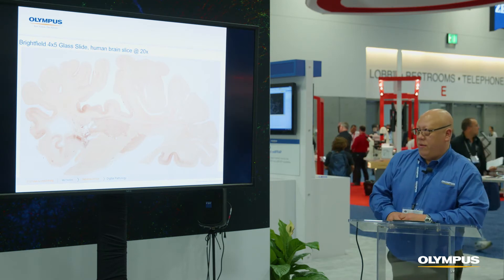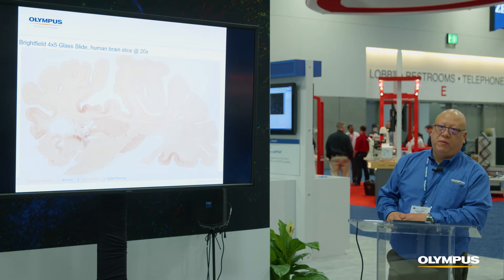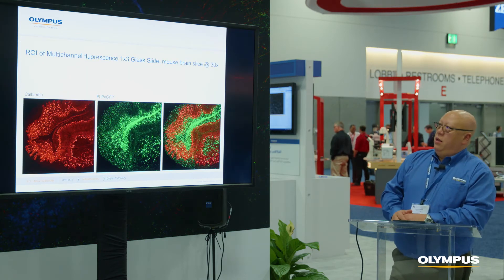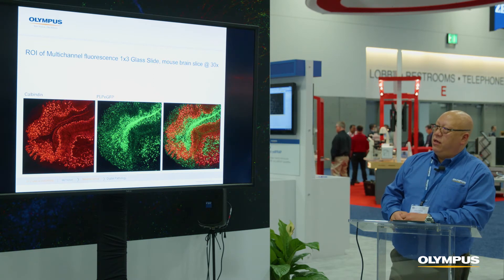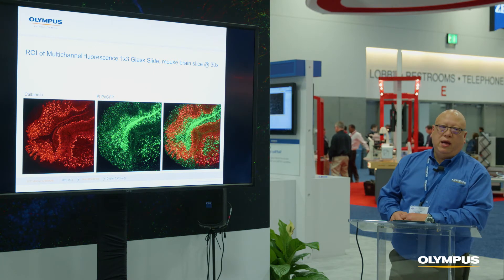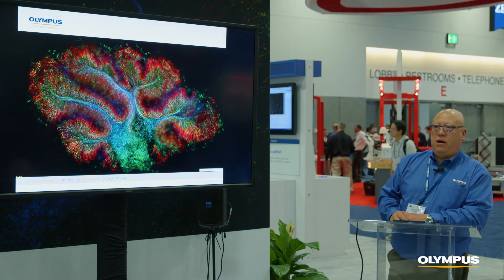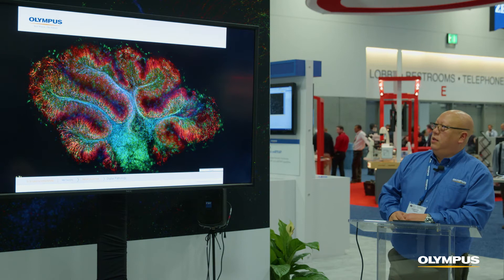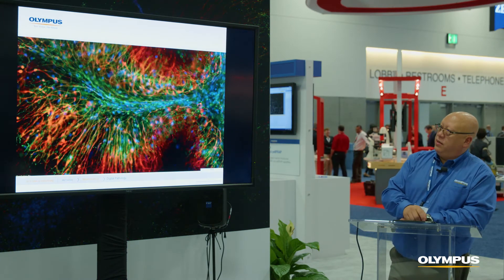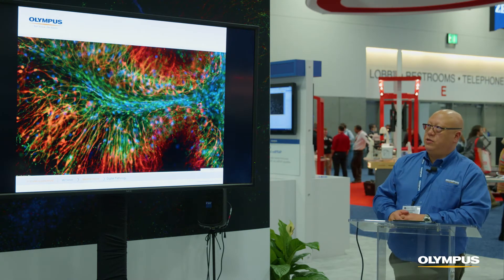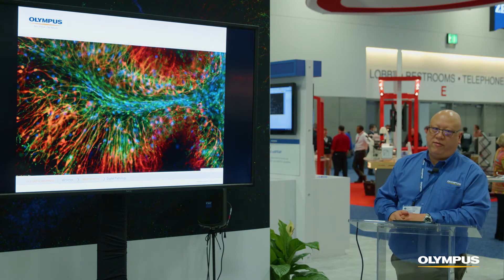This is an example of a four-by-five slide with a human brain slice — about 100 gigabytes uncompressed — with a pixel resolution of 0.32 microns per pixel when you zoom into the image. This is a region of interest for a brain slice infected with MS, showing individual fluorescent channels captured and combined in pseudo color for red and green. The whole slice was captured in 3D using a 30x silicon immersion objective, which allows seeing deep into the sample and matching the refractive index of the sample itself.